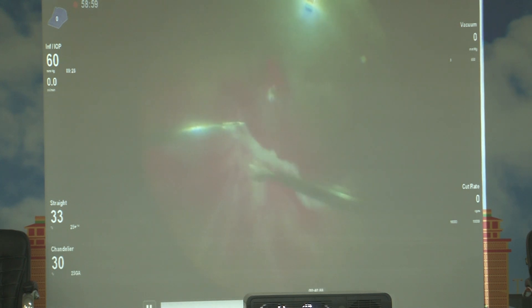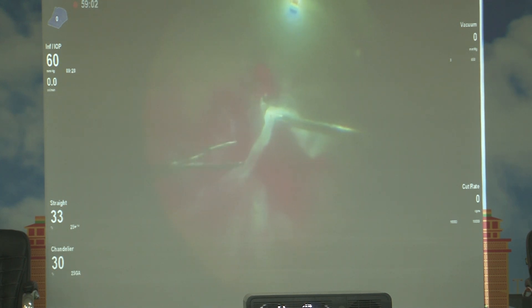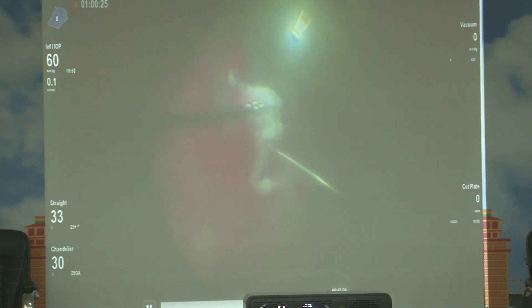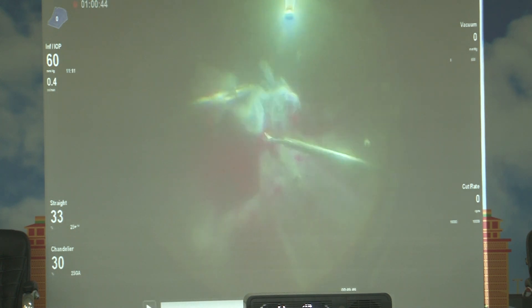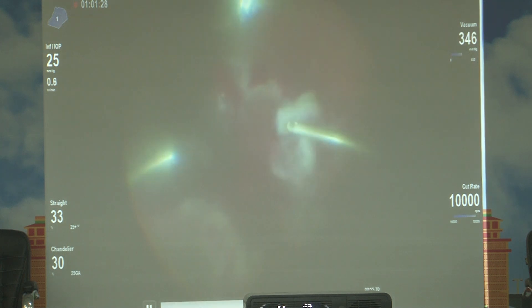There are many other filters — you can play with the gamma, saturation, hue, and most of these settings. The only advantage is: the better we see, the better we do, so that we have fewer iatrogenic breaks in these kinds of cases.